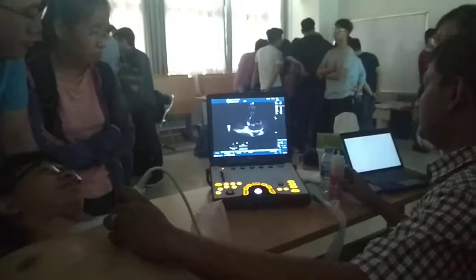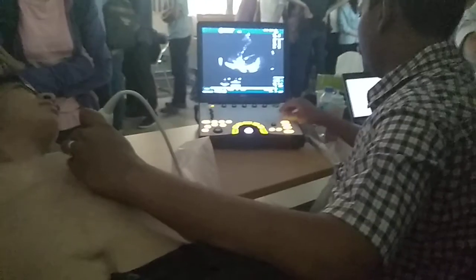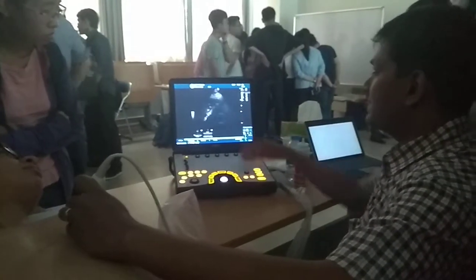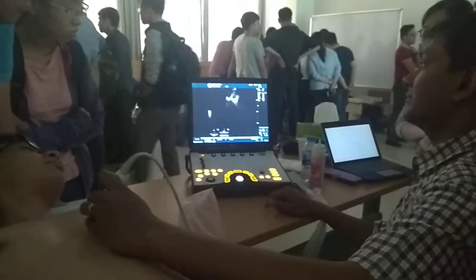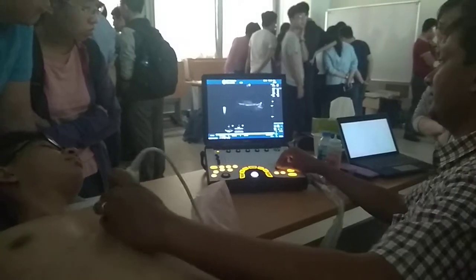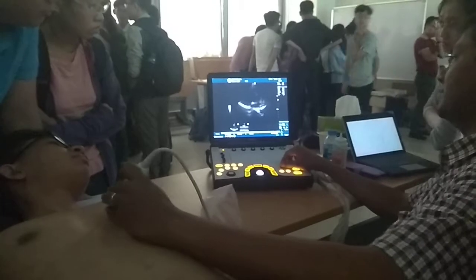Now let's see what depth we need. Where's the depth here? So now the depth here is too less. You can see the left ventricle, but you can't see the atria. Depth here is too little or too much. So ideally, what depth do you want? Keep optimizing the depth so that you can see the structure of interest here.